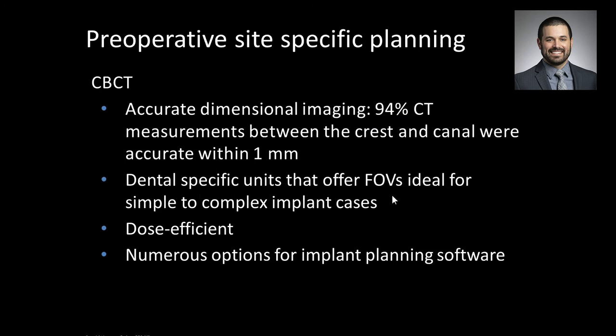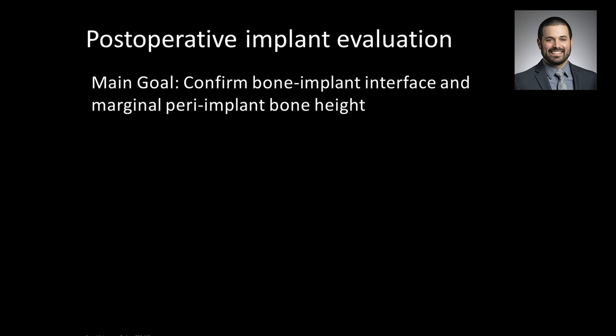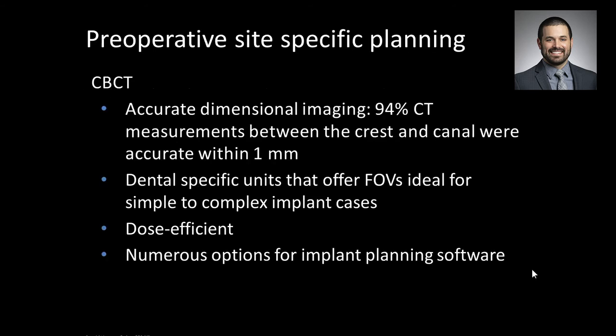The fact that we get dental-specific units with dental-specific fields of view and implant-specific software makes it really useful for us. And the best news, like we built on our discussion last week, is they're fairly dose efficient as well. We get great information for not a lot of dose. Where I'll end this is that cone beam CT is a very useful tool for many implant cases. If you are an advanced surgeon, there are many cases you can place safely without cross-sectional imaging. But from what I'm reading in the dental field, if you are new to implant placement, the cone beam CT can really steepen your learning curve for every single implant.